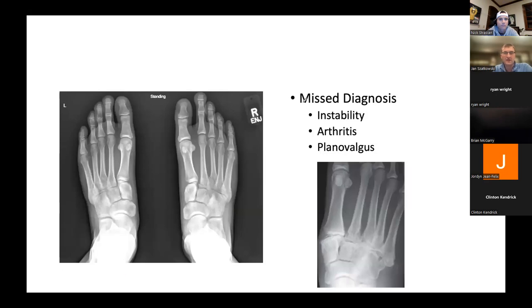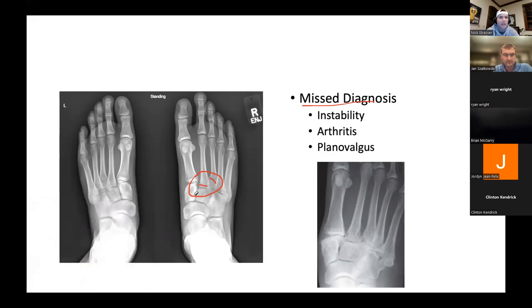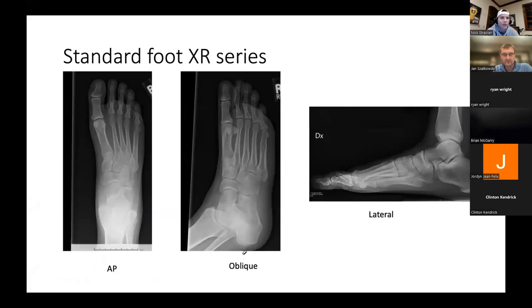Once again, misdiagnosis leads to instability, arthritis, and a valgus flat foot deformity. Just compare the two sides — you can see widening, a fracture at the base of the second, and of the third. These x-rays were also read as negative initially. The point is: take a lot of time when you're in the OR looking at all the x-rays. This is one of those cases where the more x-rays you get a chance to look at, the more you'll be able to master reading them — understanding what looks normal, what looks abnormal, and picking up on subtle changes.